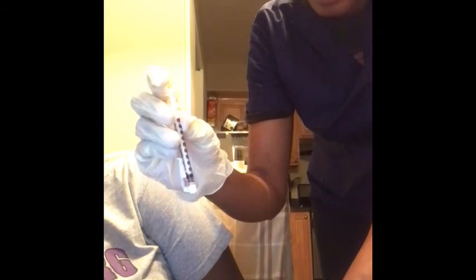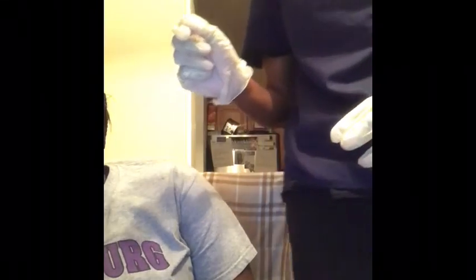And then I'm going to put the safety on this. And then I'm going to throw it in the sharps container. And then I'm going to use an alcohol swab again.